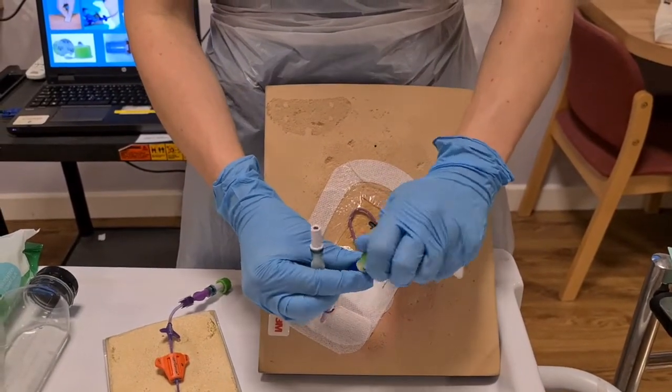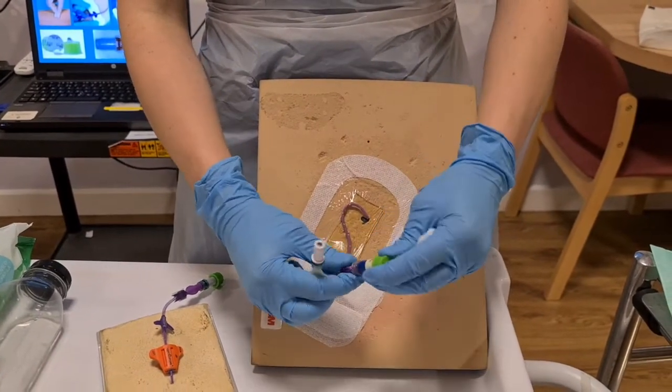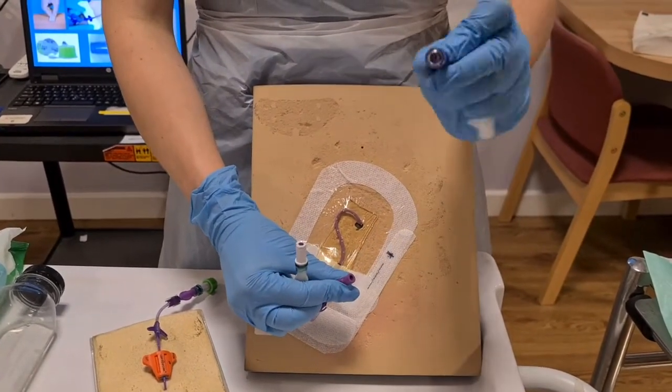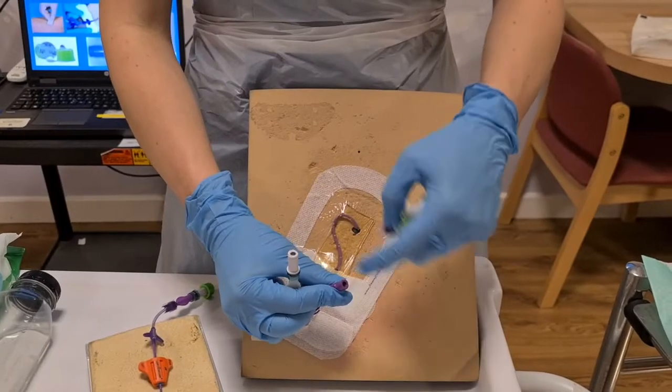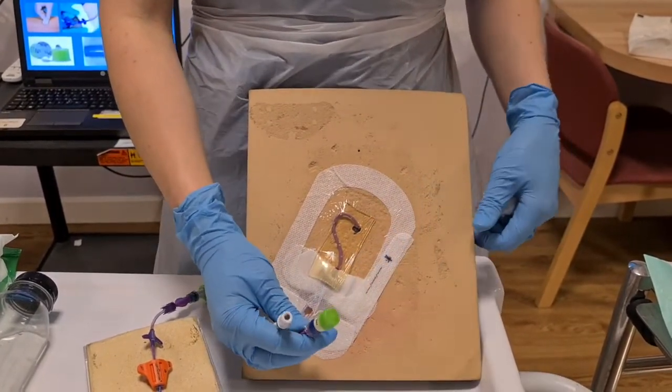And then once you're done, place on a Curos bung. These Curos bungs have chlorhexidine in them. And I will do exactly the same and replace my TPN Bionector as well, cleaning that and then placing a brand new one on. And that's how you change it.